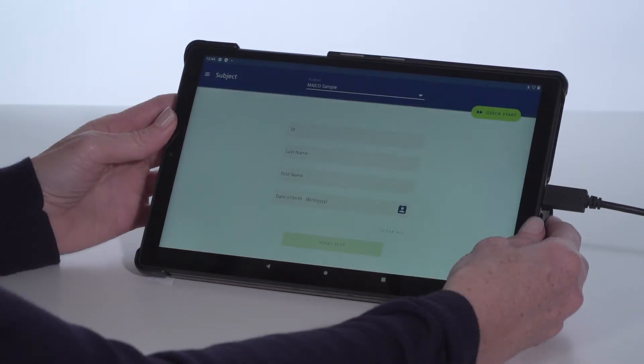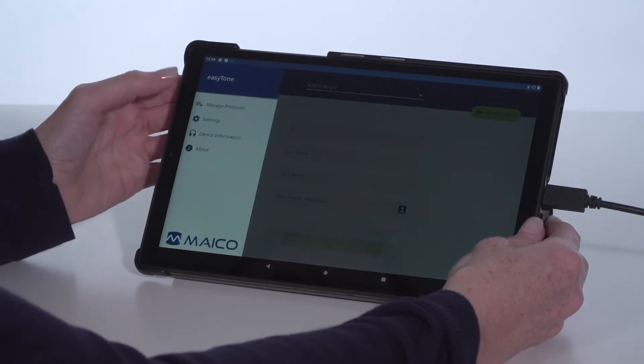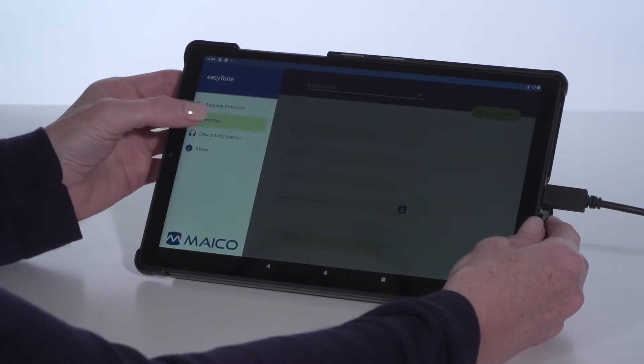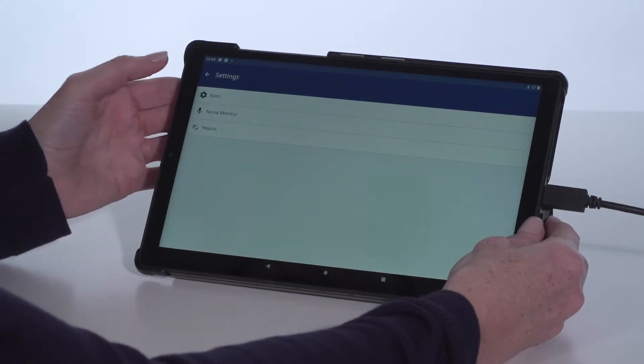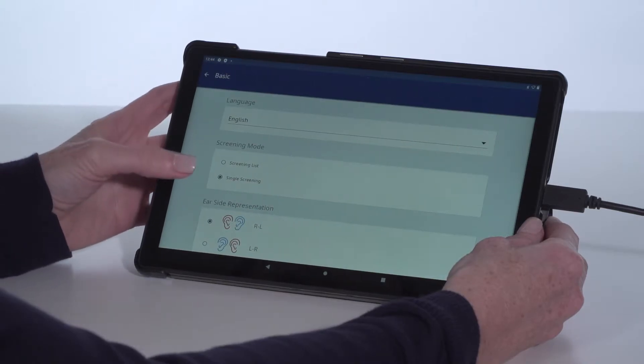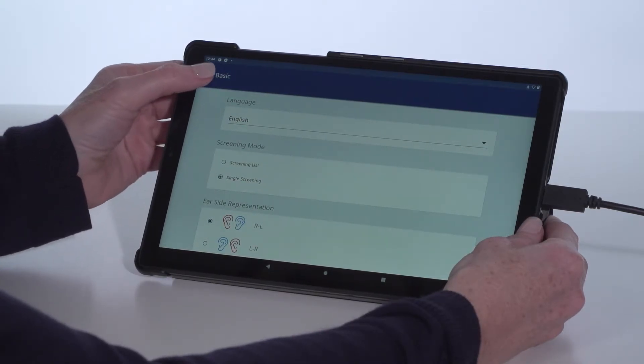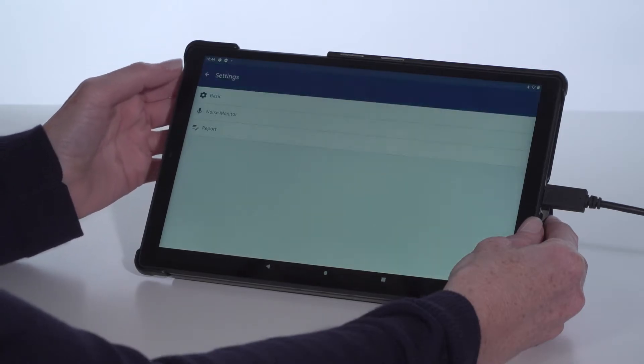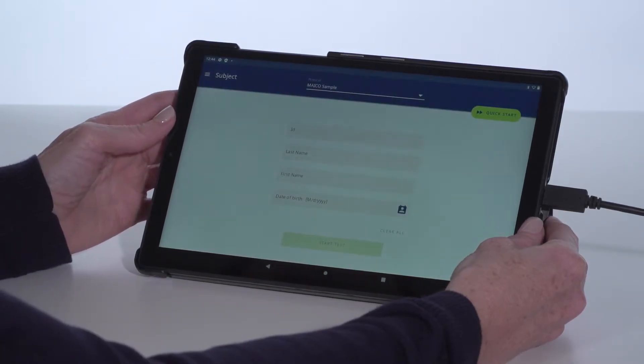Another key feature is the option of two home screens easily selected from the settings menu. Single screen allows entry of one subject, perform the screening, and print or export of results. Nothing is saved within the EZ-Tone app.